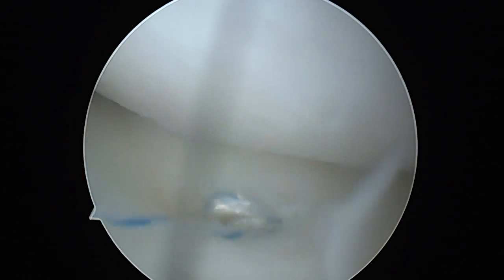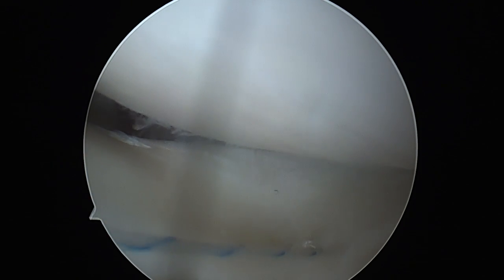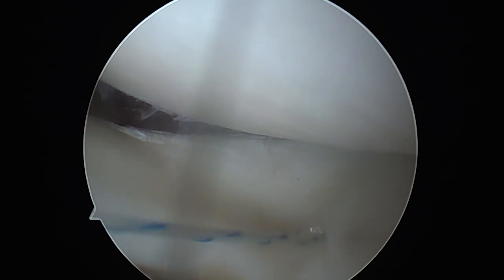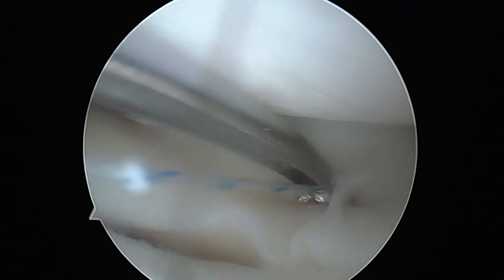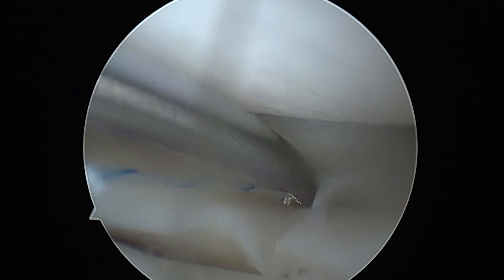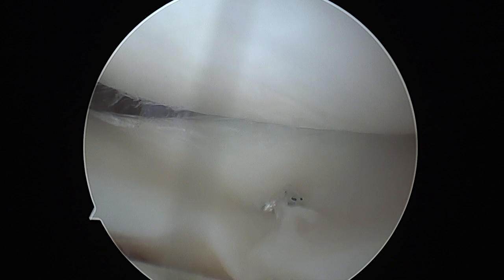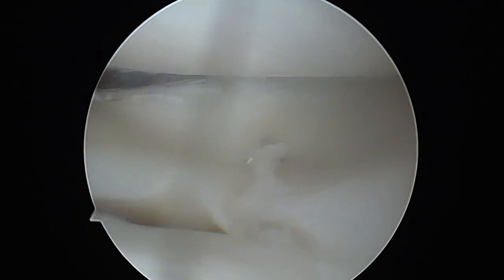Traction is applied to the suture till it fixes the meniscus back in place. A cutter is then introduced to cut the suture short. This is a vertical mattress suture. The first two are placed in a similar fashion.